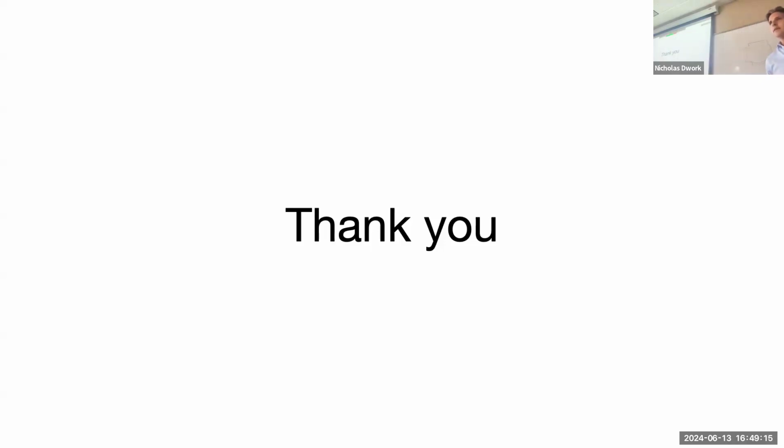So I have a question. I saw your sample number is reduced, but it doesn't necessarily mean that it's accelerating the actual acquisition, because sometimes in the readout direction, just reducing the number of samples doesn't really contribute to reducing the time. So here I've reduced the number of readouts. In 3D. Oh, it's 3D. You're showing us 2D images, but you're planning to apply this in 3D, right? Right. And so it's been applied in 3D. I've shown you slices, but yeah.